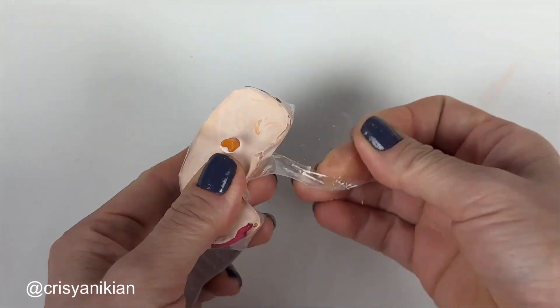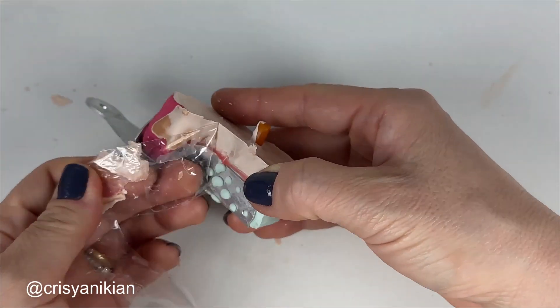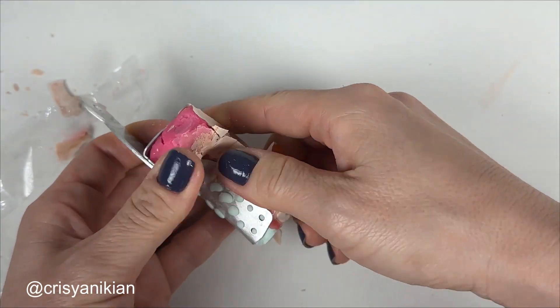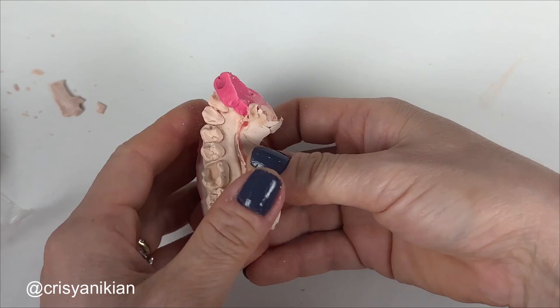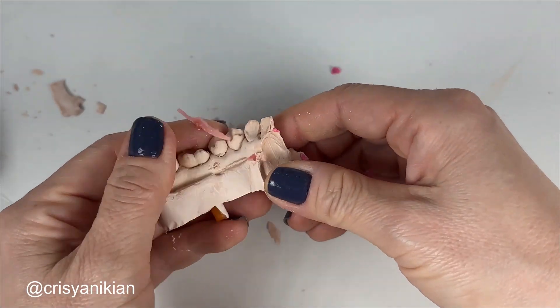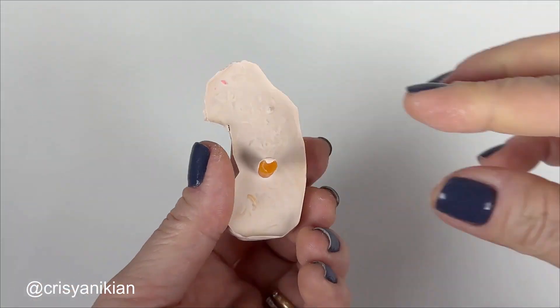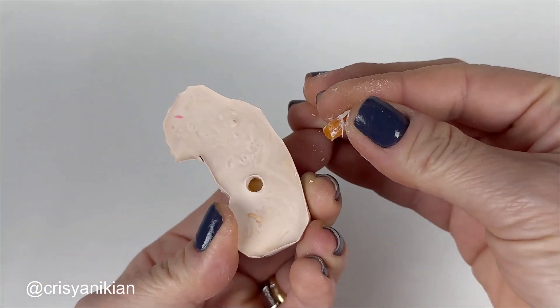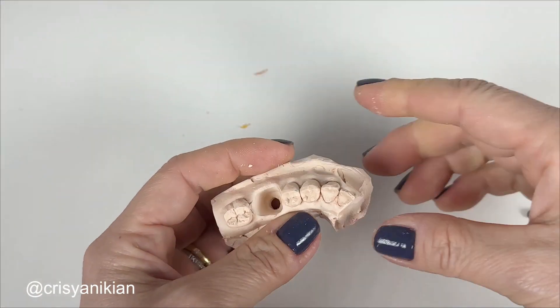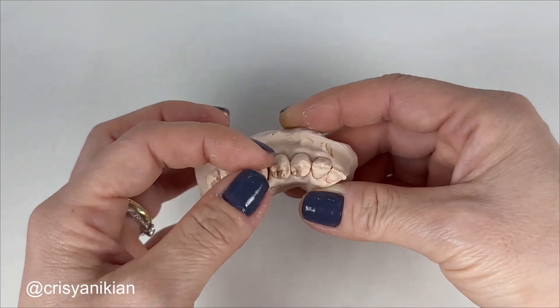Carefully remove the cast and remove any wax or modeling clay residues stuck to the plaster. Release the die from the plaster using a blunt-tipped instrument to push it out. And so the cast with the alveolar die is complete.